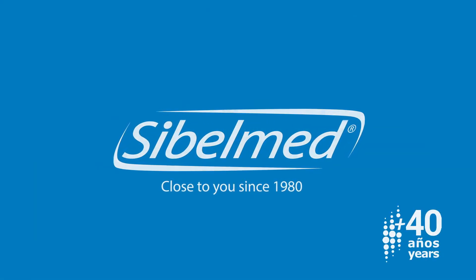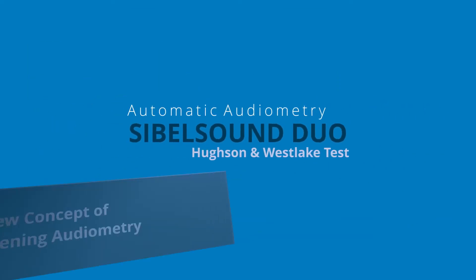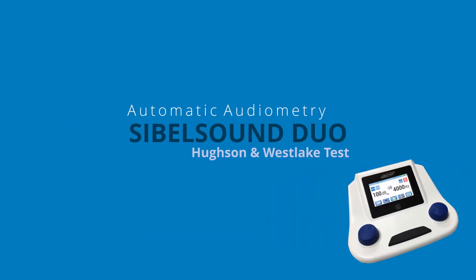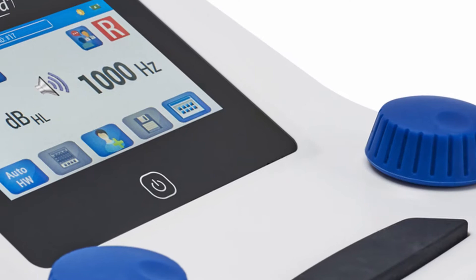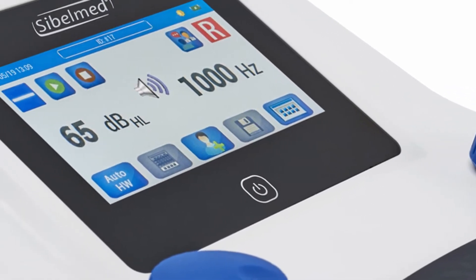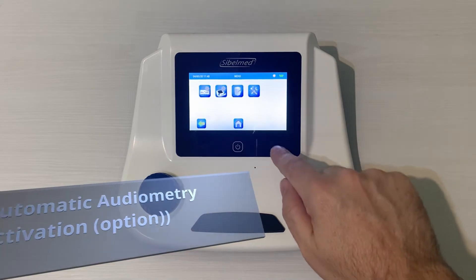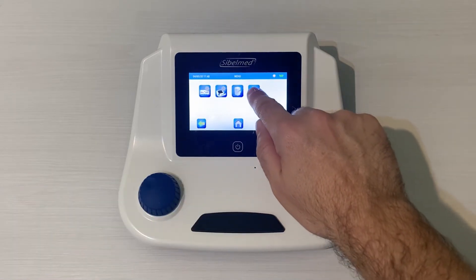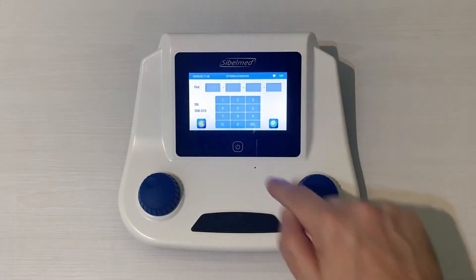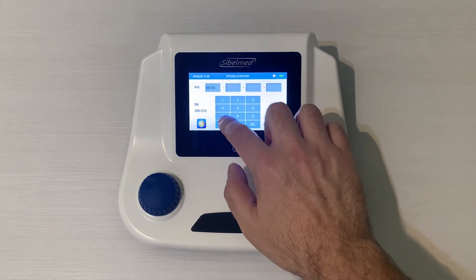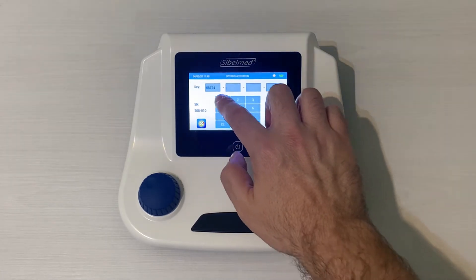Let's check the automatic audiometry module of the audiometer Sybil Sound Duo. This is an option for the audiometer, so if we need to activate it we must follow these steps: the Configuration icon, Maintenance, and the key icon. We will use the 20 digits located on the CD label and confirm.